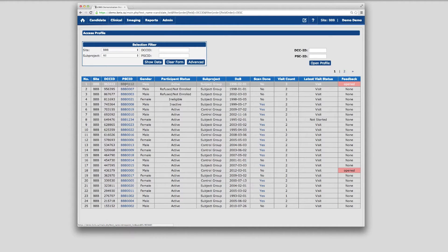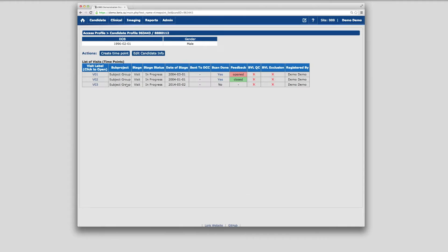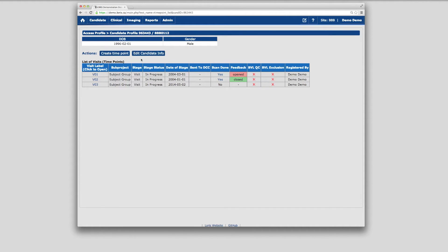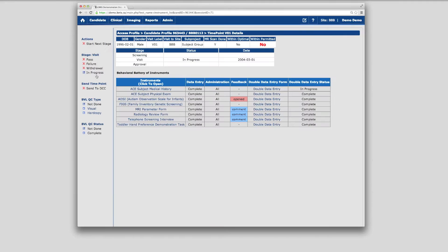Clicking on any candidate ID will take you to a list of all of that candidate's data collection time points in your longitudinal study. At the top, you will see buttons to create a new time point and view or edit metadata about this candidate. Clicking on one of the time point labels will display the battery of behavioral and clinical instruments for that subject at that time point.